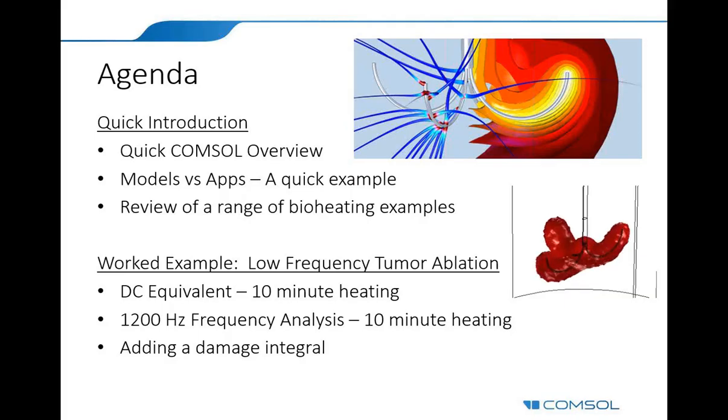And what you're looking at on the right, where it's expanding, is the actual envelope of a tissue necrosis. In this case, 60% of the tissue or more or less is damaged within that envelope. And COMSOL makes it very easy to calculate that. So we're going to do that particular example problem with those three steps in it.